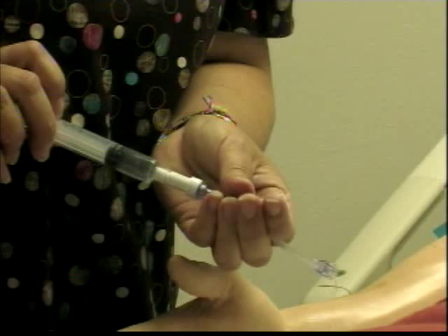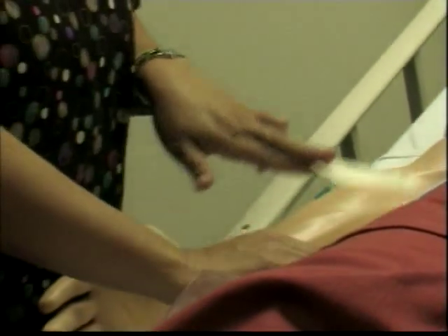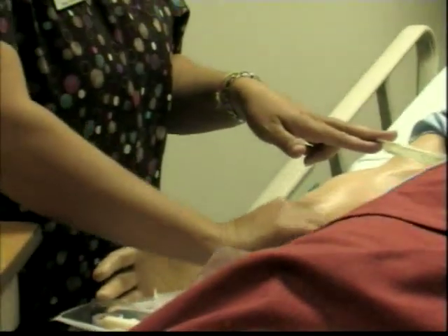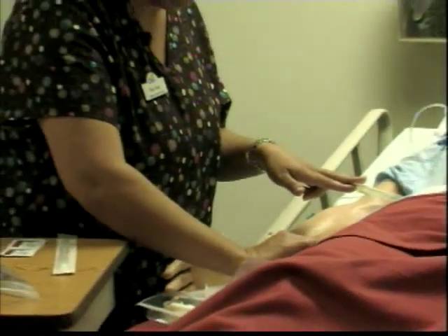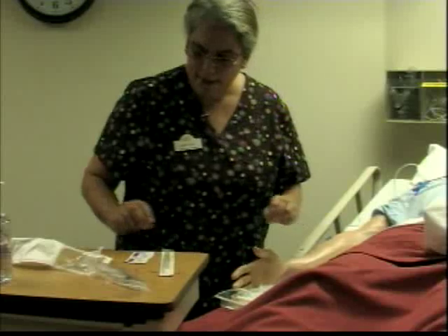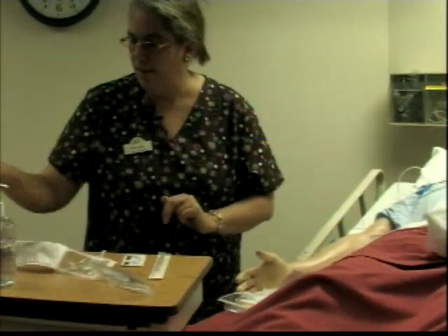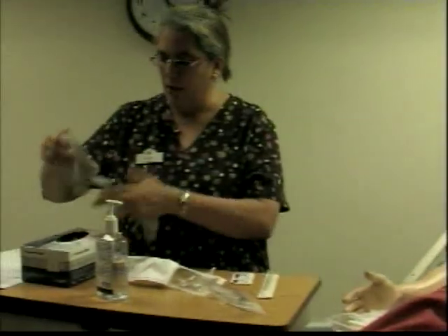And I will prime, make sure that I get all the bubbles out, and I will put it in such a way that it doesn't get contaminated and it's easy access. Okay, there we go. And we have the tourniquet. Okay, so I'm just going to go ahead and put my gloves on.